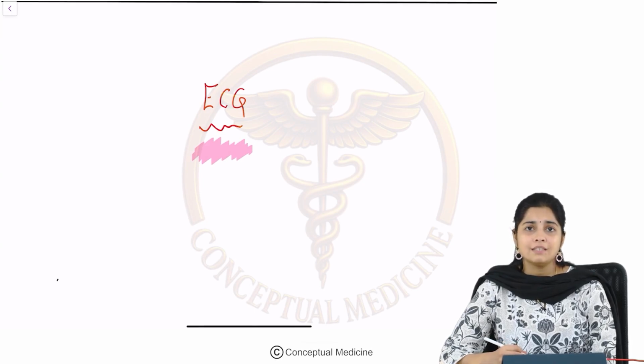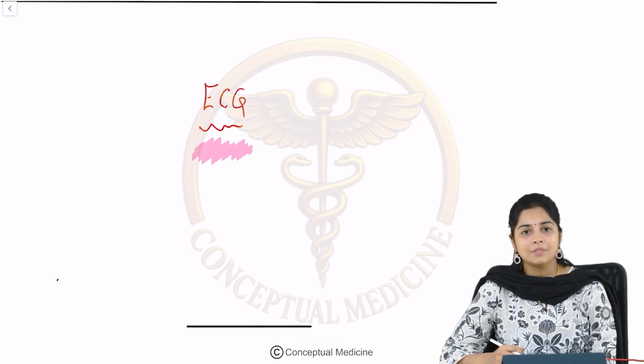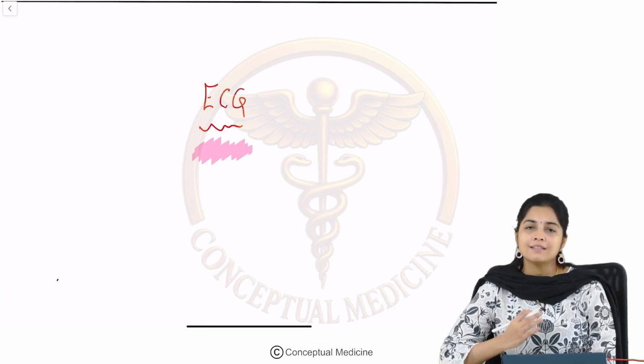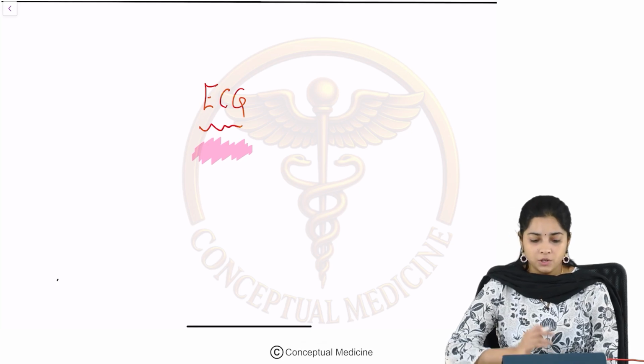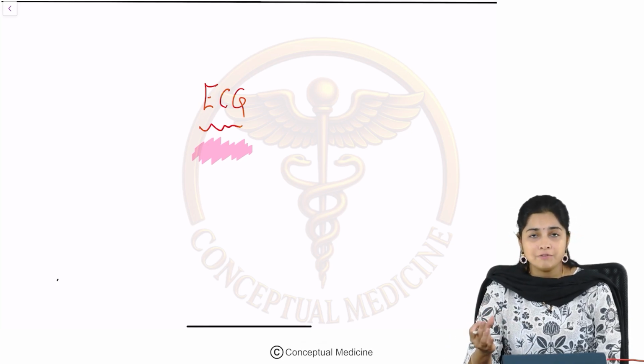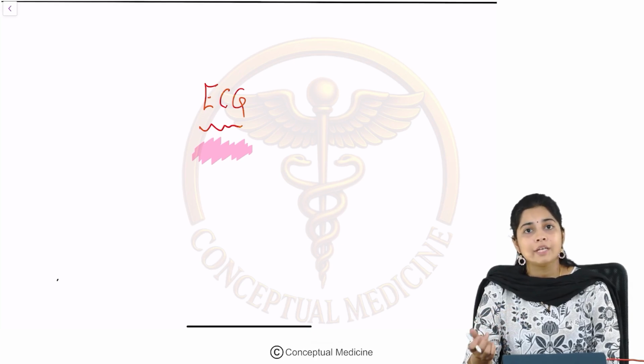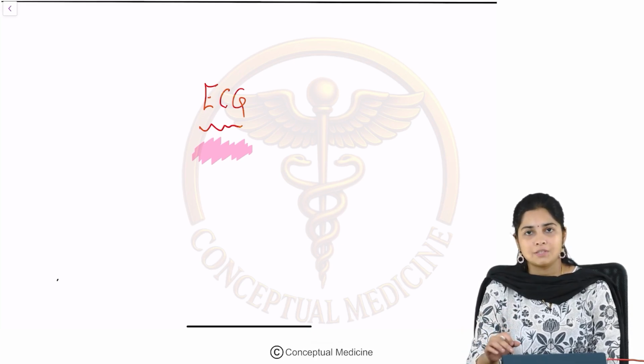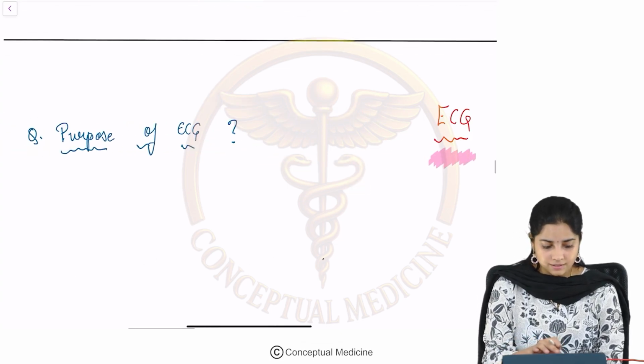Today we'll be discussing a very important and interesting topic, which is often considered to be a difficult topic by many of the students. So this is the ECG. With the help of line diagrams and simple diagrams, let us try and understand this ECG. We'll start off with the basics of ECG, how each of the waves in the ECG is formed, and then we will discuss the various pathologies. Okay, so let us start.